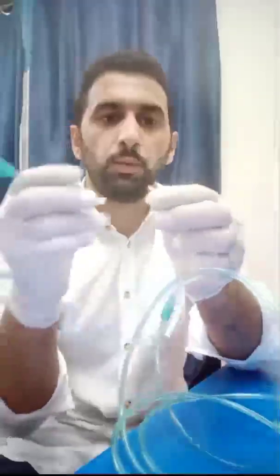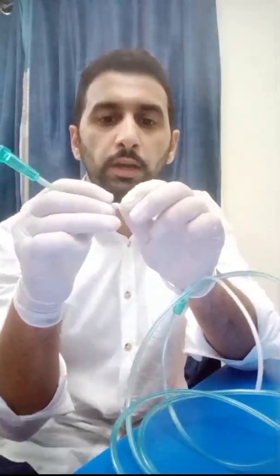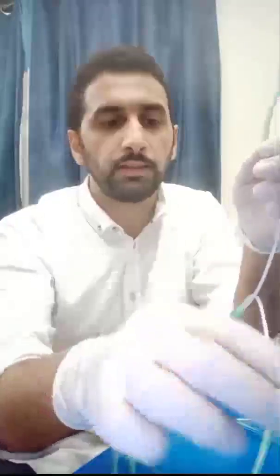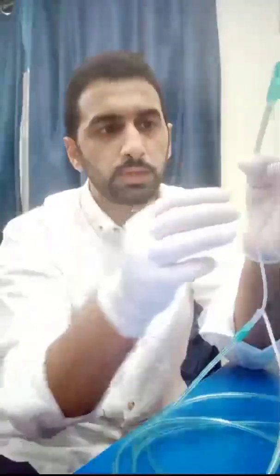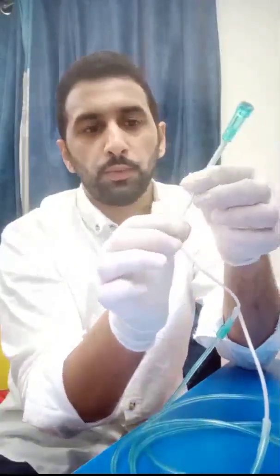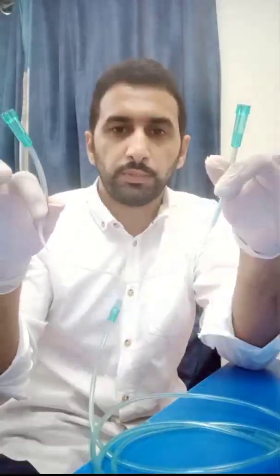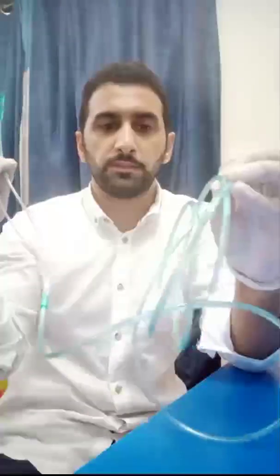Step three: take both removed ends and connect them to the Y-shaped tube. While inserting, push in as deeply as possible to prevent any air leakage, then seal the connection using surgical tape. I prefer this paper tape because it molds and makes a tight seal at the edges of the connections. What I now have is a Y-shaped tube with the ends connected, and the nasal part is free.